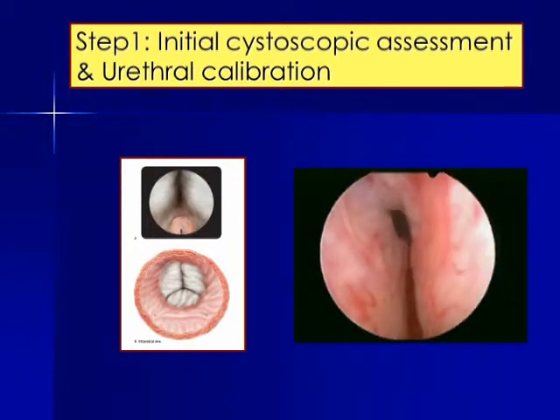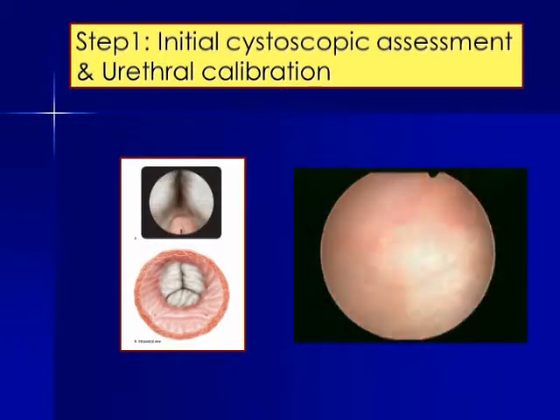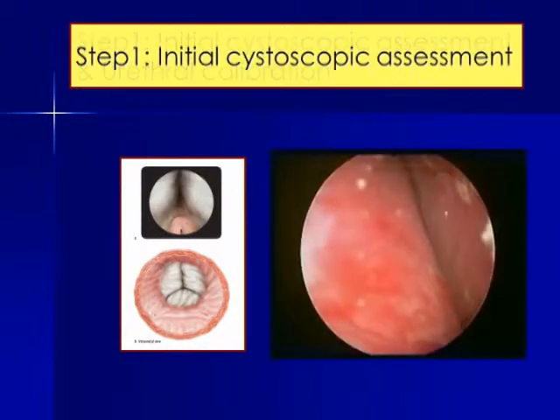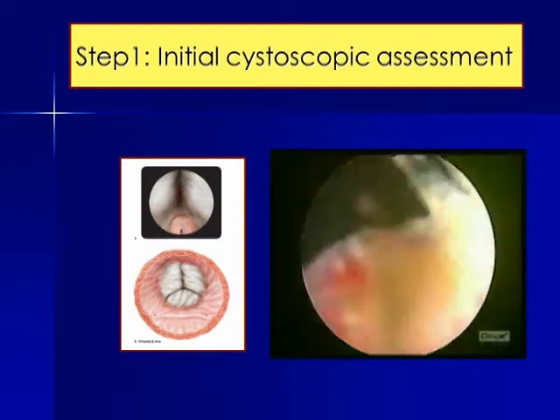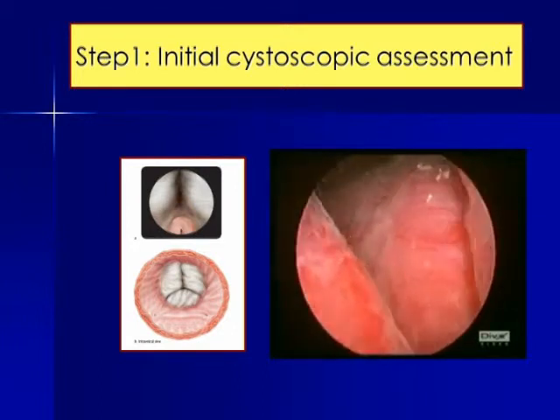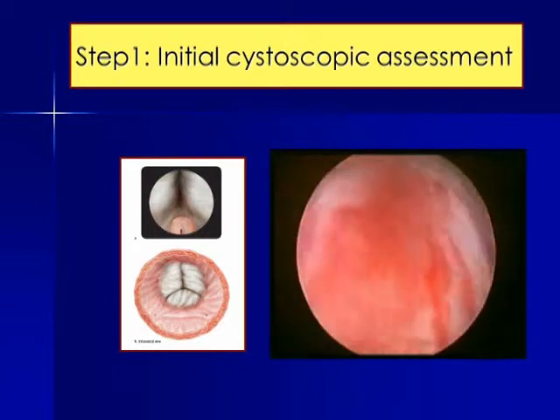of prostate, see the lobes, whether they are 2 lobes or 3 lobes, and take the advantages of the naturally existing grooves in the prostate, which can be incised, deepened, and the lobes can be manipulated. So the technique of the enucleation will be decided, whether it is 2 lobe or 3 lobe to start with, based on the anatomy of the prostate. And we should always spend more time, maybe initial 5 minutes, to study the anatomy, see the lobes, see the grooves, and then plan our incisions accordingly so that we have a good enucleation at the end of the surgery.